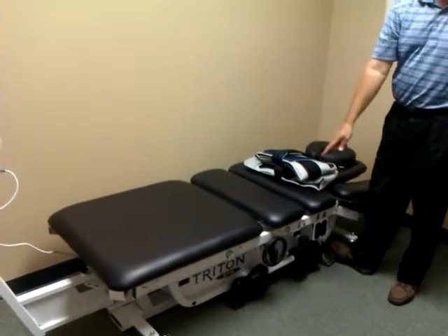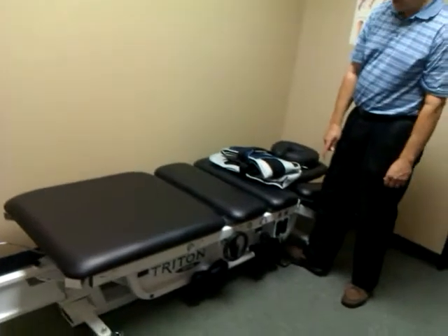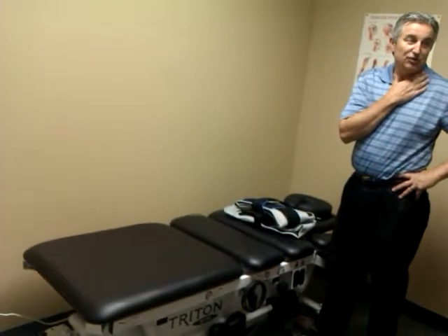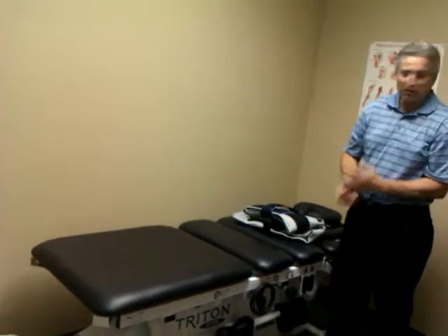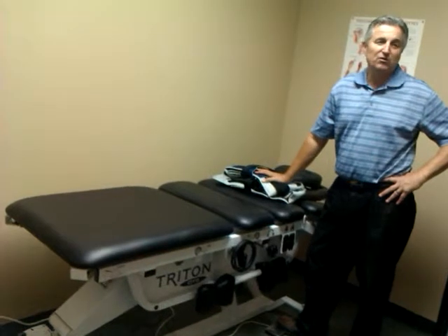If you do get back up and want to adjust, it's low enough — you can adjust right here. This will also come up to 40 inches. So if you get to the end of the day and you're tired and don't want to bend over anymore, and you're working on a neck or a knee and not using it for decompression, use this because it's going to keep coming up to 40 inches so you don't have to bend over at all.